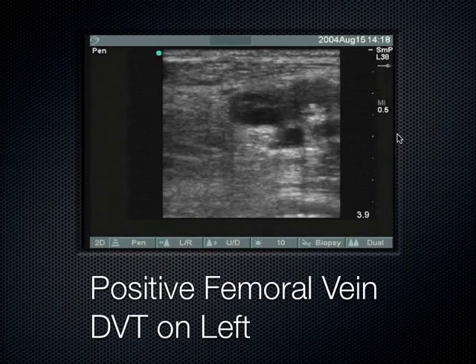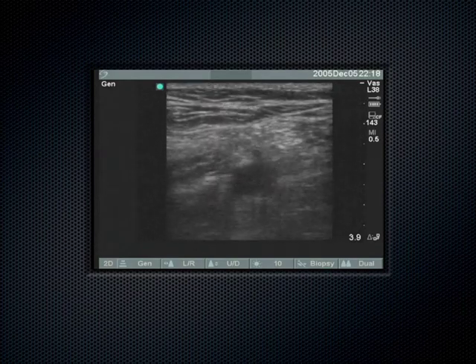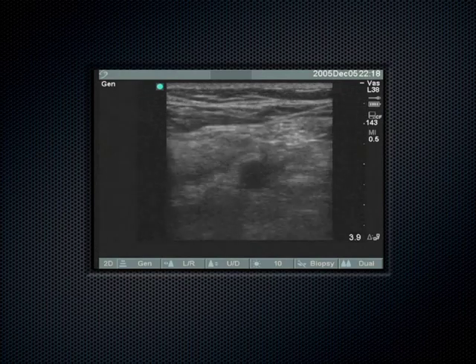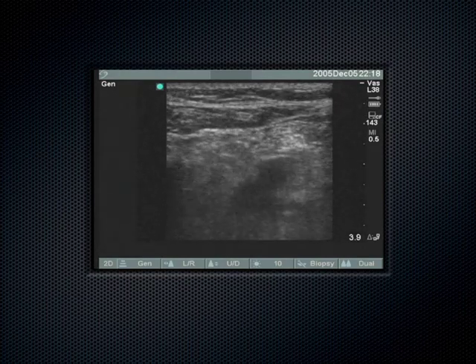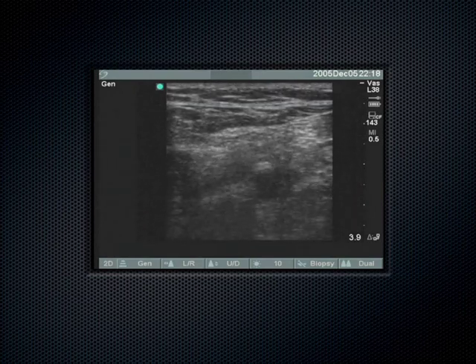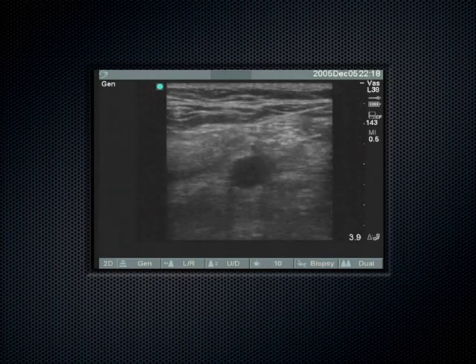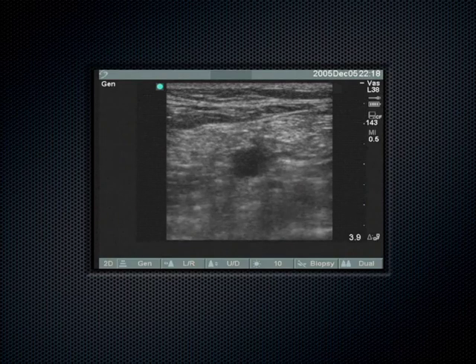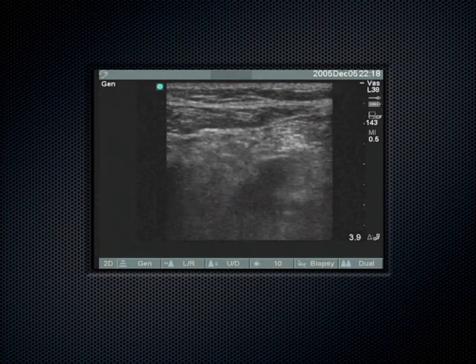Okay. Now, how about this one? What's going on here? There's another pitfall. Where are we? Hard to know. Turns out, now you know. See that? This kind of gets at the Frank Netter drawing a little bit, actually. Interesting, after I told him that you don't see this. I'm going to pause it when it becomes clear where we are, so we're pushing right there, and then there. So this is the popliteal fossa.